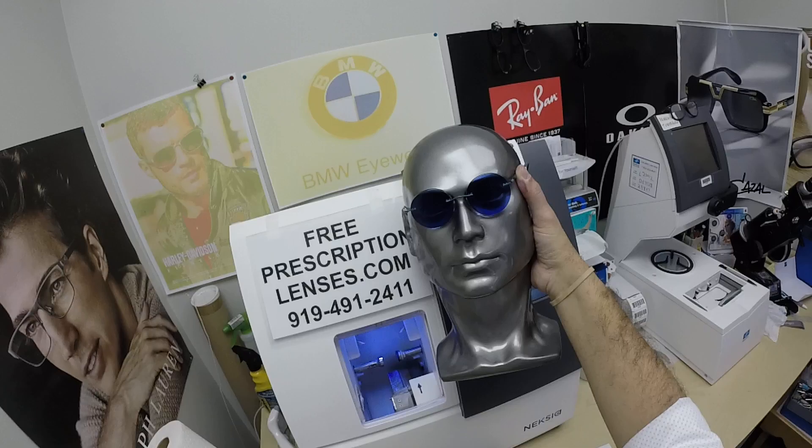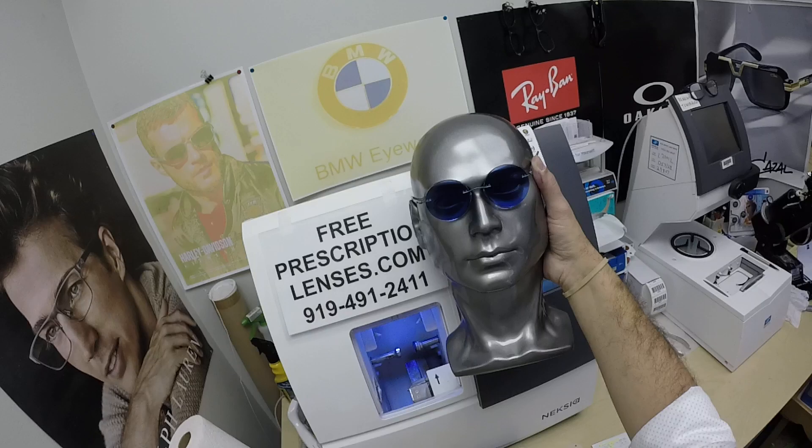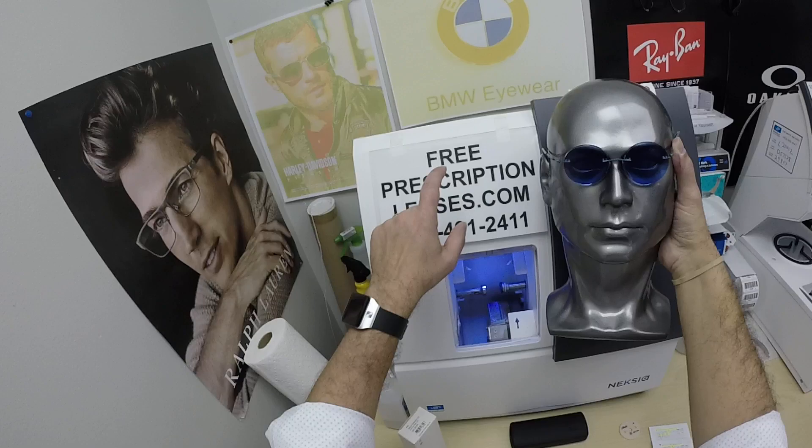We don't have this frame on the website, but we do custom orders. Macy contacted me after seeing my other videos and asked if I could get Silhouettes — yes I can. The frame sells for $300 complete with one free pair of clear single vision lenses. The upgrade to the Zeiss Progressive is $149, the Photofusion Blue is $99, and DuraVision Silver is $79. All prices are tax free with free shipping anywhere in the U.S.